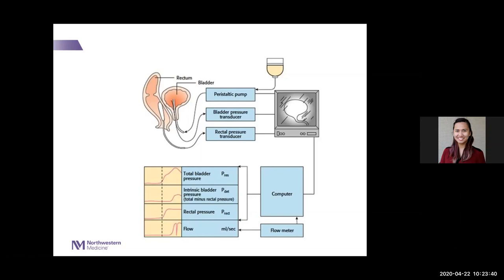But nowadays the bladder catheter has a pressure transducer on it, and typically it can have two, depending on what you're looking for. PVES just measures the total pressure within that bladder. So that's what PVES is, pressure vesicle, right? And you can also have a little pressure sensor here, which we typically do, which measures urethral sphincter pressure. To get that in the right place, you certainly don't have to have fluoro.